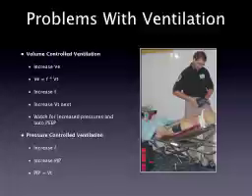Now, if I'm in pressure-controlled ventilation, I don't actually have a set volume, but what I can do is increase my peak pressure, because I actually set my PIP. So if I want more volume in pressure-controlled ventilation, I have to increase my PIP. And that's exactly what I said down there: PIP equals tidal volume. Higher PIP, higher tidal volume; lower PIP, lower tidal volume. Again, I want to look at increasing the rate first, and then move on to increasing the peak inspiratory pressure, again attempting to keep my pressures as low as possible.